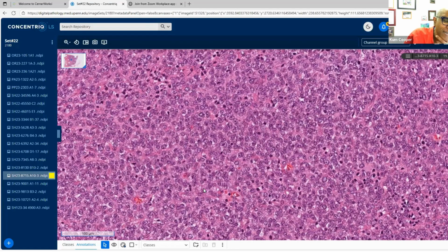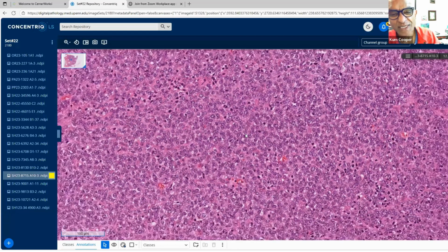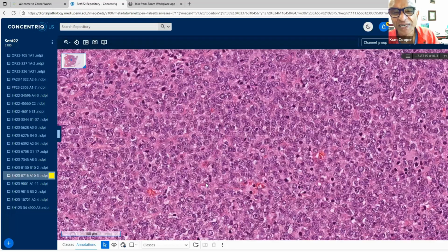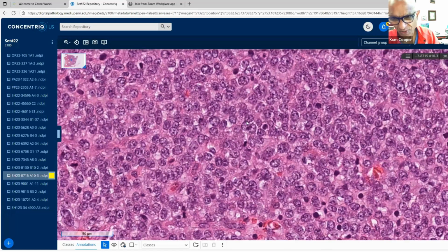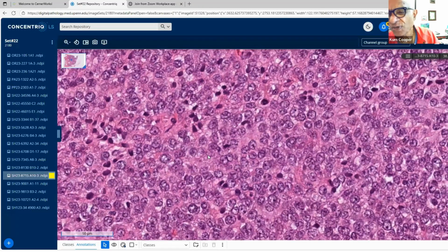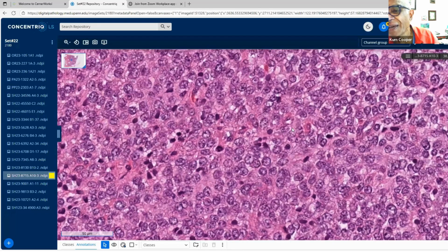Okay, yes, they are very rare. So here we have then, nobody has said Ewing sarcoma, which I'm happy with because the cytoplasm is not quite right for Ewing sarcoma, and the nucleoli are not right for Ewing sarcoma. So these can have nuclear pleomorphism as well.